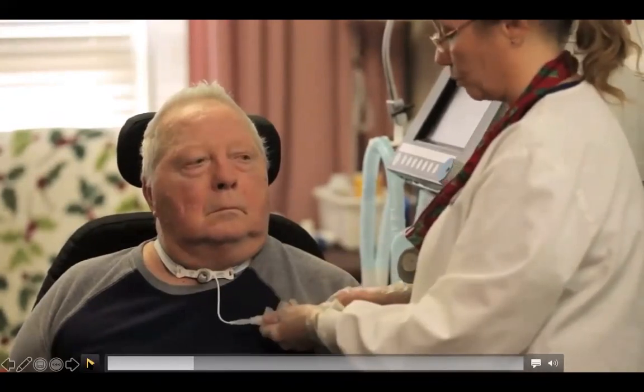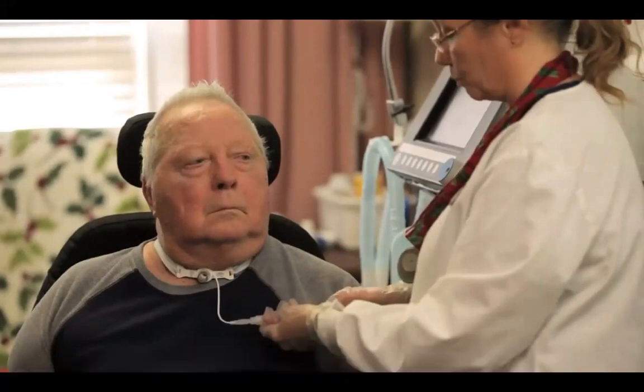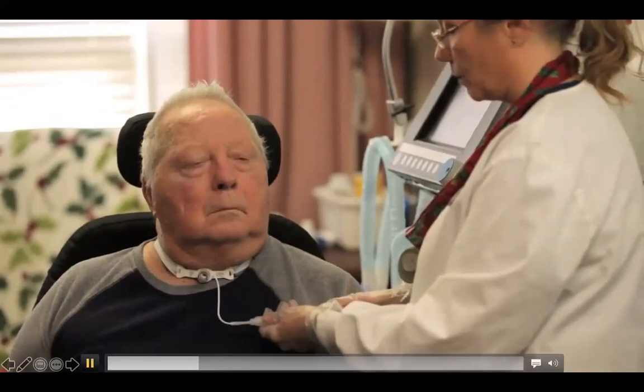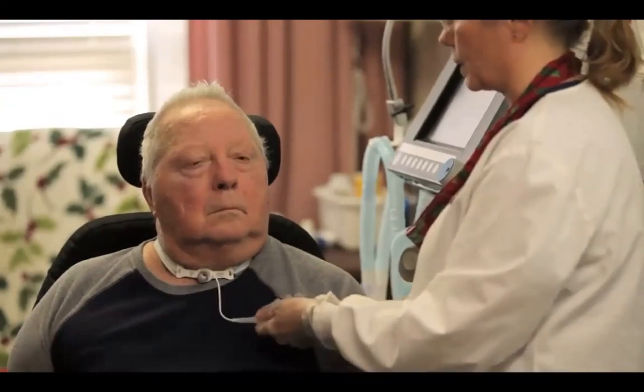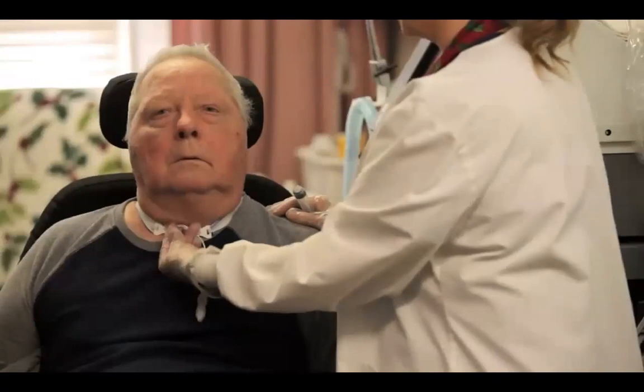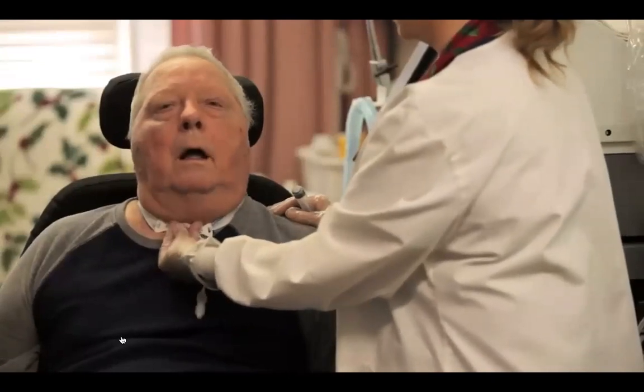And when you're deflating a cuff, you have to deflate to negative pressure. It needs to be deflated very, very well. It cannot even be partially inflated. Take your cuff all the way down. It's very important to take the cuff completely down. You want to make sure it's totally empty. If it wasn't, we'd have a problem. 1, 2, 3, say off.